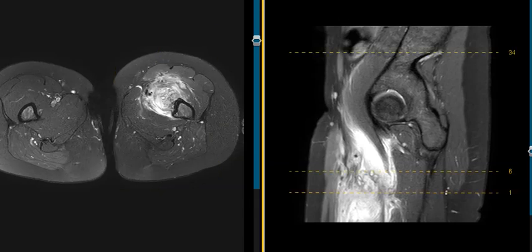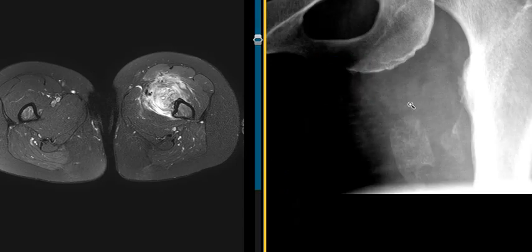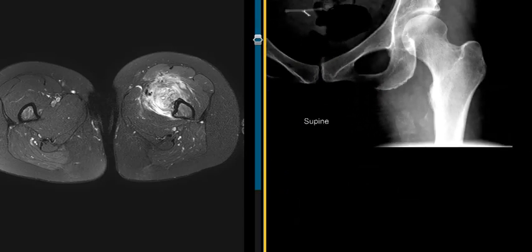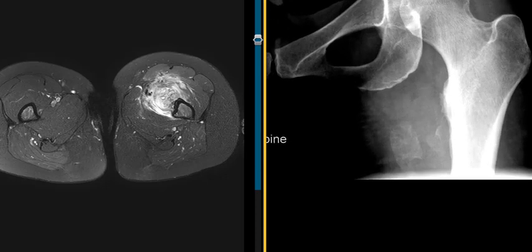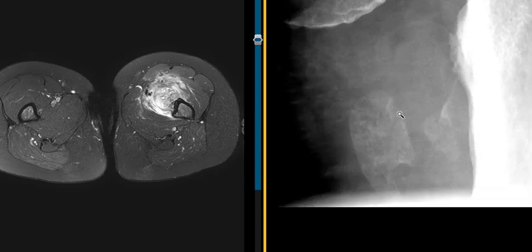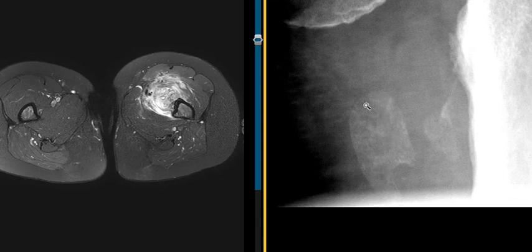This is an x-ray from about a year before. If we zoom back, here's the femoral head and neck — this is the same region here. We see this rounded area of bone density, some calcification or ossification here. So this is what myositis ossificans looks like — this geographic region of ossification related to where they've had the muscle injury and hemorrhage.